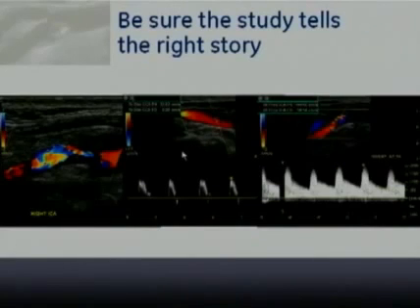The highest velocity she got as she sampled through the internal carotid artery was 200 centimeters per second. This could be right, but I'm suspicious that the velocity is probably much higher than that, because when I have such a low velocity common carotid artery with high resistance flow, I would expect an even higher velocity reading in the stenosis. And in fact, this area of stenosis looks to be much tighter than that.